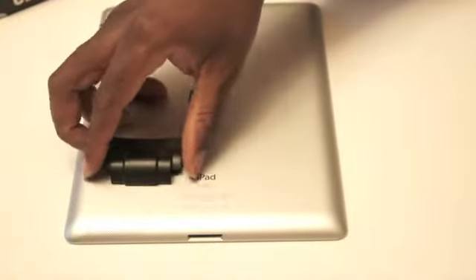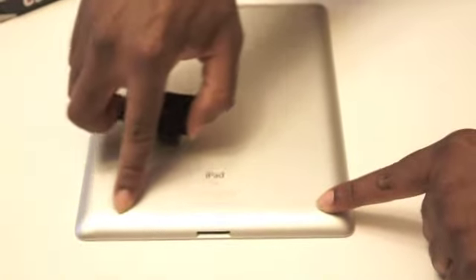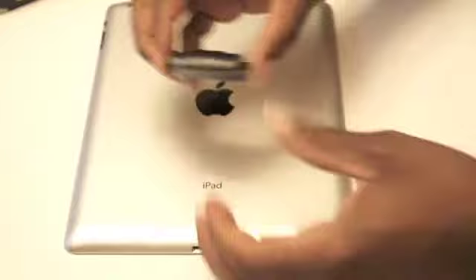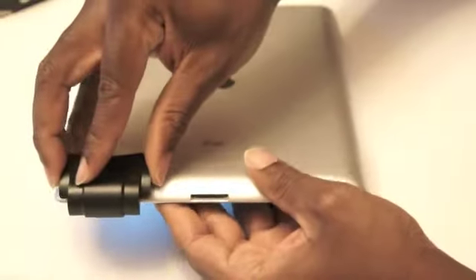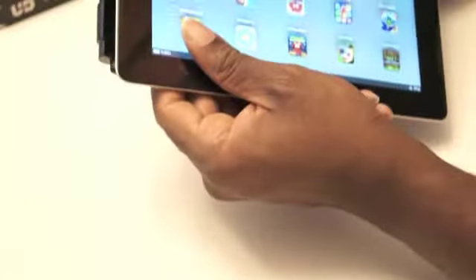Today we're going to talk about how to use FOCO. The sticky pad of FOCO will be attached towards the back of the speaker of the iPad. The curved sides of FOCO will lay on the curved sides of the iPad. There are two ways to attach it. You can come from the front over the speaker — that way the curve matches the curve there, and the FOCO is on the back and on the front too.